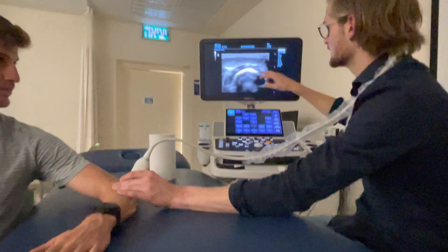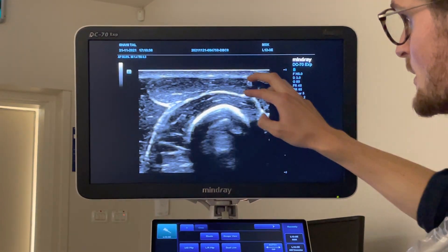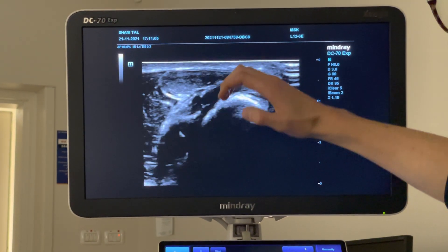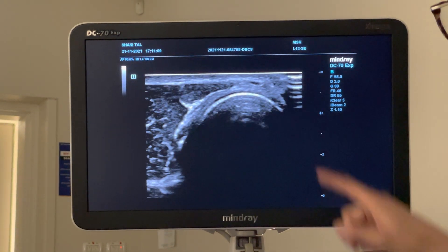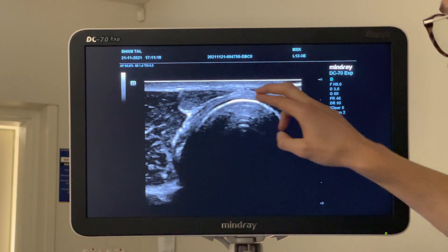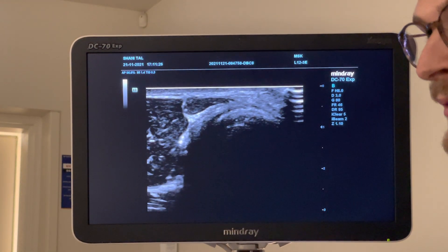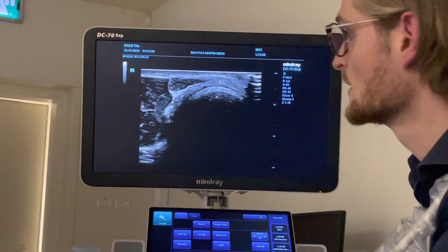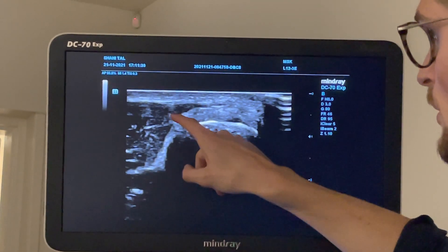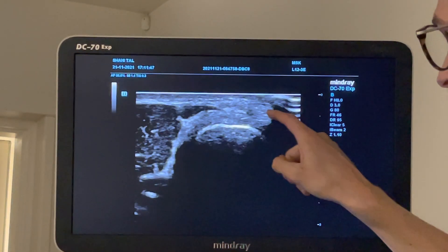I start more distally above the radial shaft actually. This is the supinator muscle. These are the common extensor muscles. I go more to the proximal part — the bony cortex will come up because we go to the radial head. Here is the radial head. You can see it with the hypoechoic or anechoic appearance above the cortex — that's the cartilage. Then we have the annular ligament over there. If we go a little bit more proximal, then we don't have a bony landmark anymore because we're in the joint space between the radius and the humerus. I go a little bit more proximal and then we have a perfect example of the lateral epicondyle here. We see the longus — this is brachioradialis.